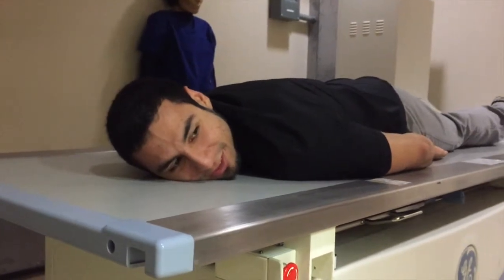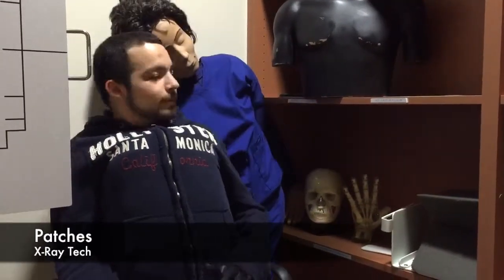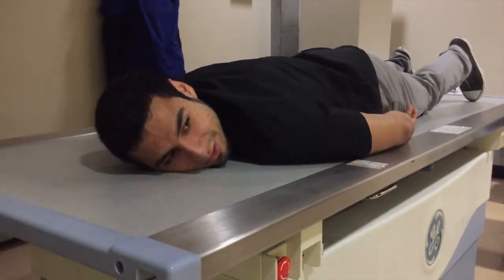Hey Patches, so what does this actually show? Well, this projection shows fractures and inflammatory processes of the facial bones, the orbits, and the mandible. Alright, that's pretty cool. I hate being asked questions. So what do we do next, Patches?